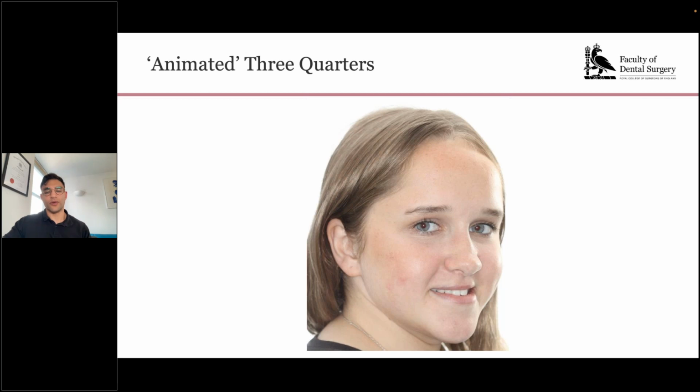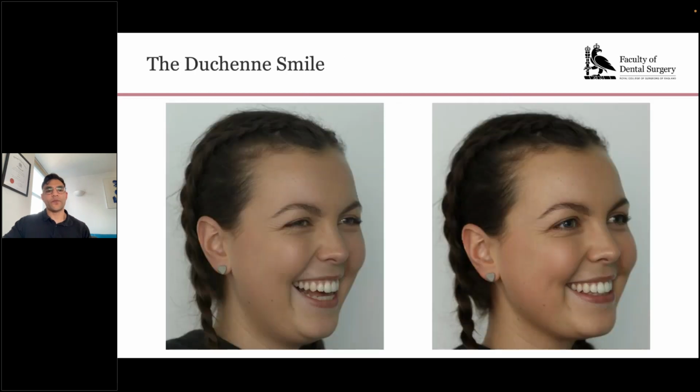It's like a school photo kind of photograph. So a word about the Duchenne smile. People often ask, especially when you're working with moody teenagers, how do you get them to smile? That's a really difficult thing to do, because the temptation is to try and make them laugh by saying something funny or get mum to pull a funny face in the corner. But the trouble is that can actually genuinely make the patient laugh.